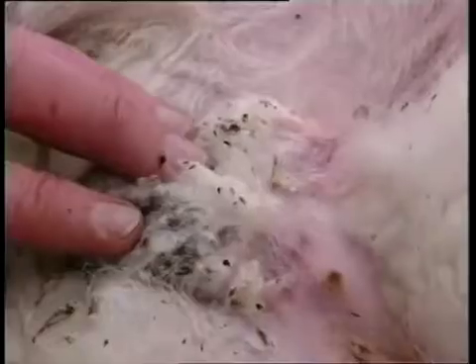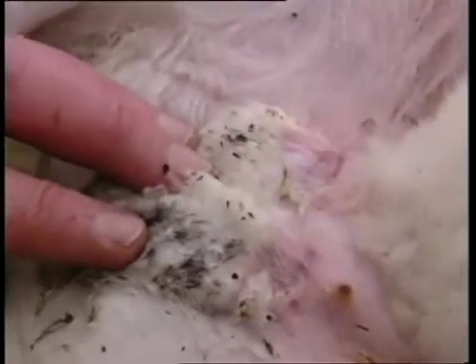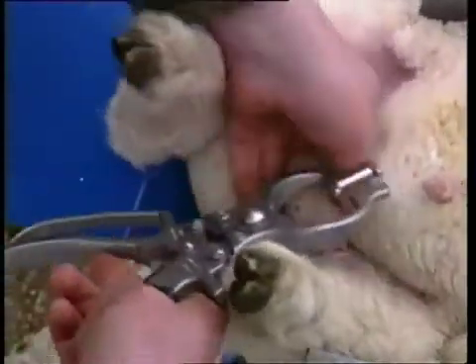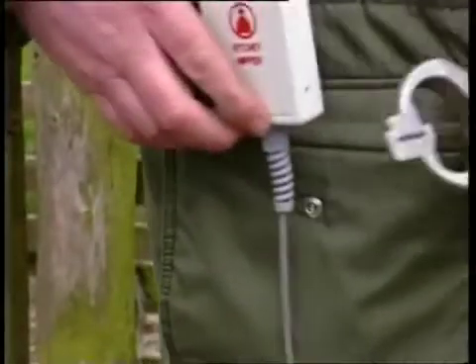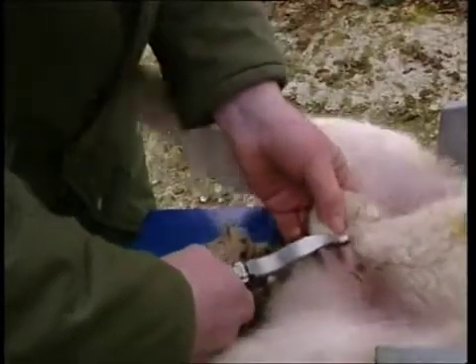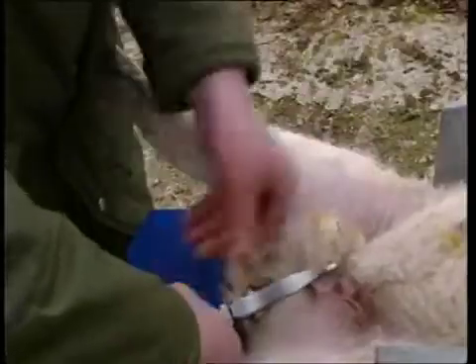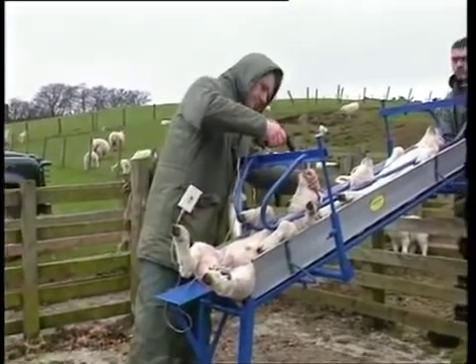To ensure castration has been effected successfully, shepherds have usually applied the bloodless emasculator to each cord twice. However, in SAC's trials, a single application to each cord correctly applied has been nearly as effective with a very low failure rate. It's still important to minimize the area of the scrotum crushed by the jaws — the indentations made should never overlap or join up, as this may cut off the blood supply to the whole scrotum. A timer has been added to alleviate the problem of the castrator being applied for too short a time. This is activated as soon as the jaws are fully closed and bleeps after 10 seconds until the handles are opened. The timer can be clipped to clothing or to the handling apparatus to allow other tasks to be carried out whilst waiting for the bleep.